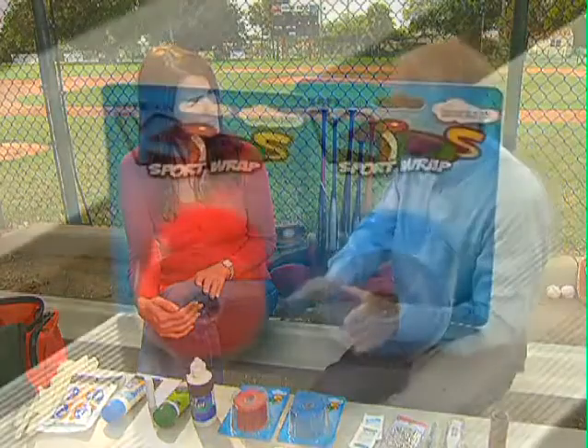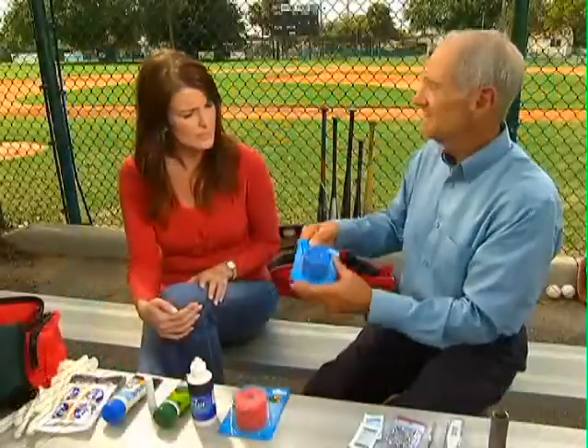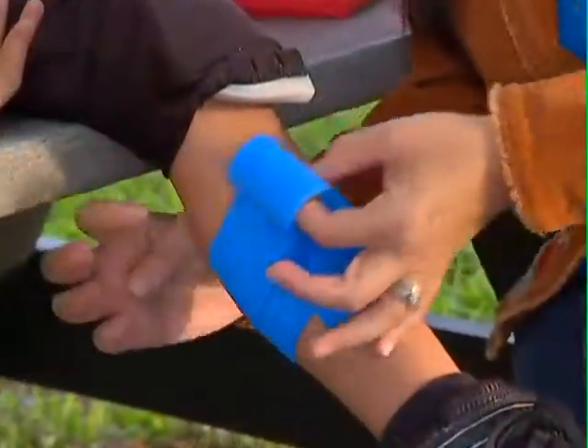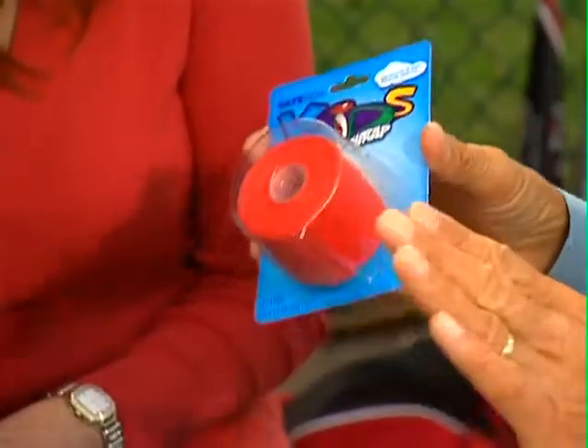And now they've devoted their attention to first aid for kids. And what are these colorful things here? These are Safe Skin Sports Wraps. First of all, they're water resistant. They're latex free for allergies. They're self-adhesive, so you don't need pins and clips and all that stuff. That's so nice — makes a big difference. And they're colorful. Kids think colorful is cool.